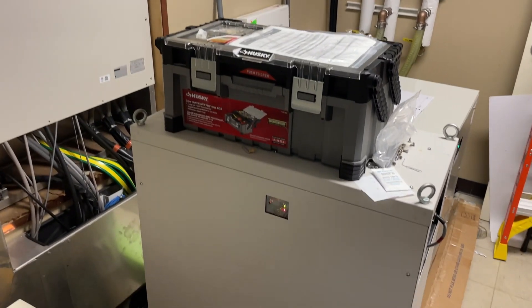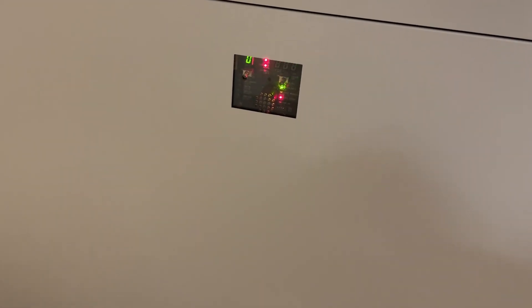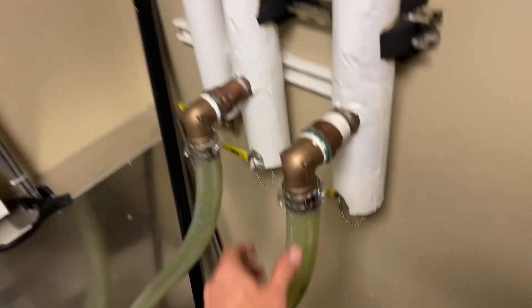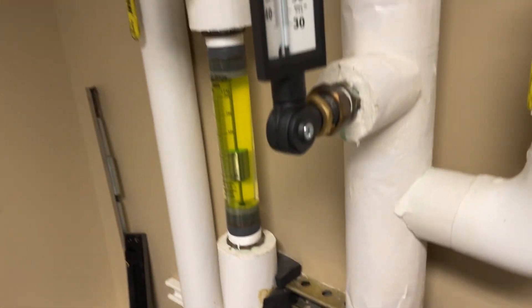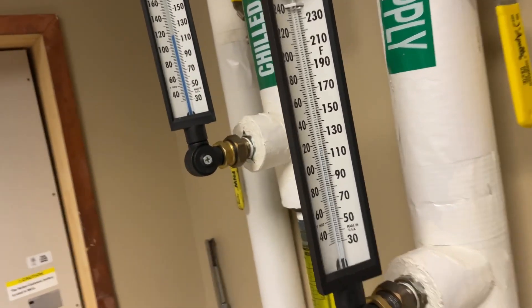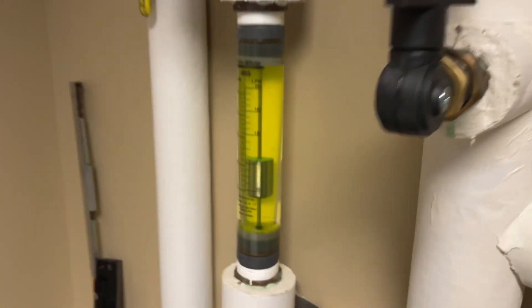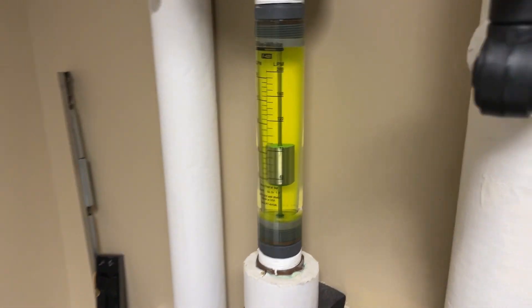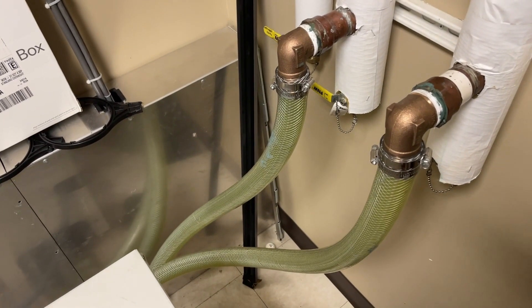Got a chiller for an MRI system here acting up. I have never worked on this system or even anything like it. It does feel like we have flow although it's way too hot. I'm not even sure how much flow is normal, but we do have some, so we'll go outside and see what's going on out there.